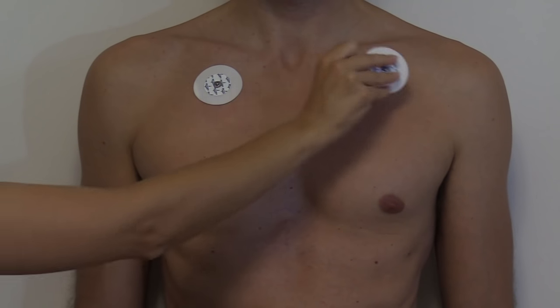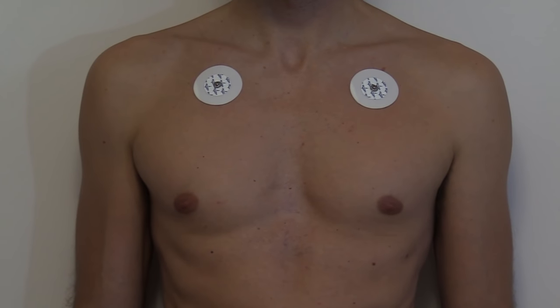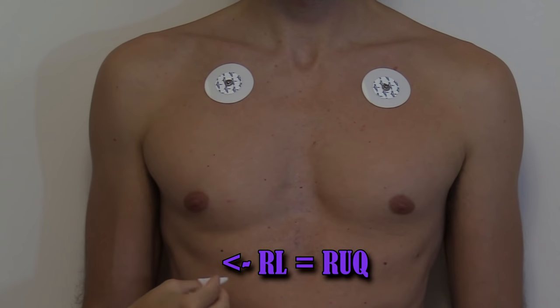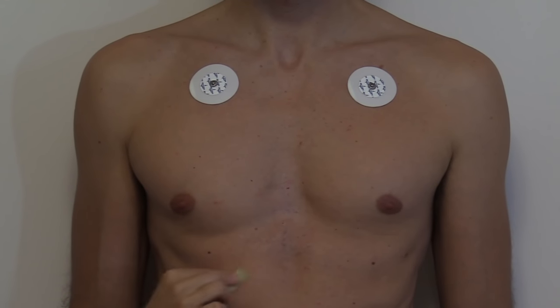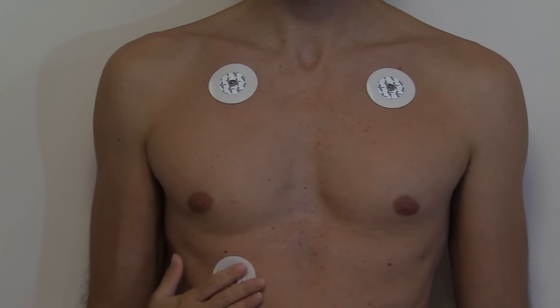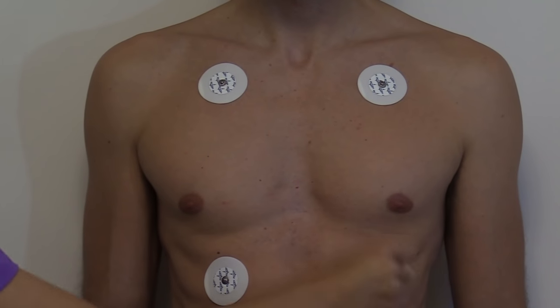Now let's do our leg leads. For the right leg we're going to go down to the right upper quadrant — again you can place this on the leg. Cleanse the area, gently rough up the skin, and put our electrode in the right upper quadrant. Now for the left leg we're going to go in the left upper quadrant — cleanse the area and place our electrode.